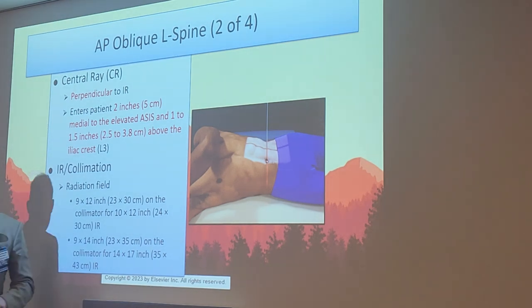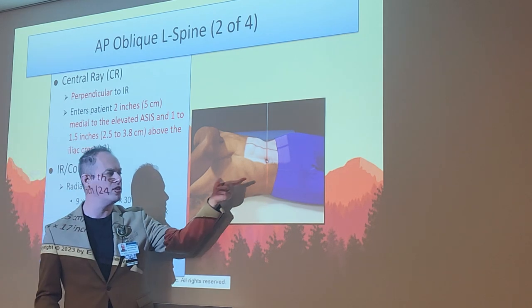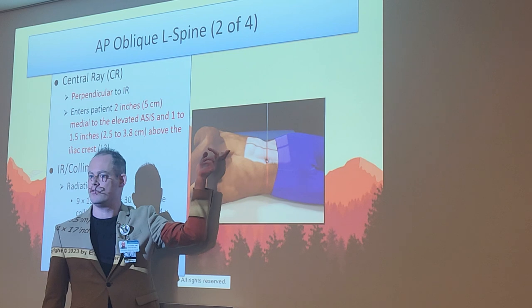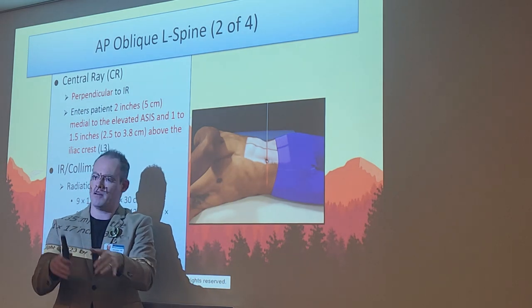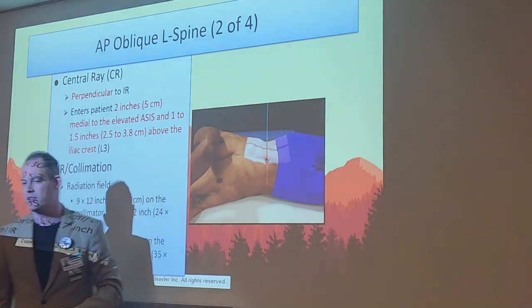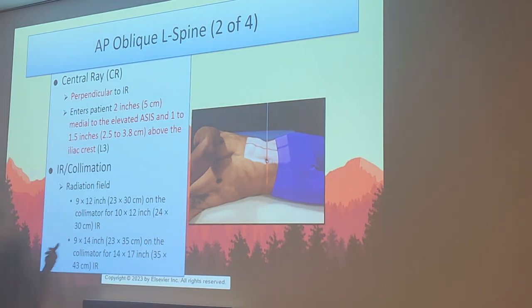But where people make the biggest mistake, and be careful, guys, is people for some reason always want to center on the downside. Make sure you're centering on that elevated side. Use the nipple line, use the hand technique with your thumbs. Make sure you're slightly above the crest as well. And you're going to nail it every time. Beautiful x-ray when you do it right. So we always center on the upside? Always on the upside. Because we're only ever going to do our LPOs and RPOs.